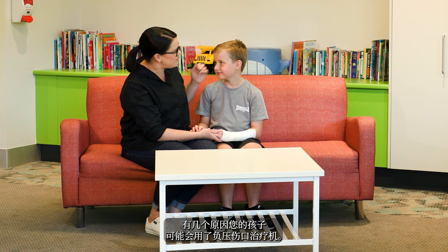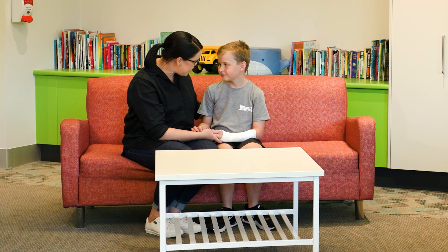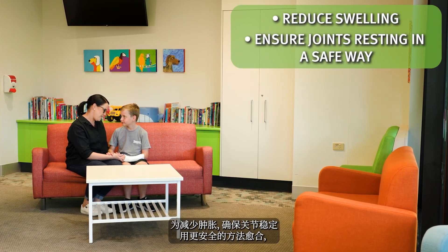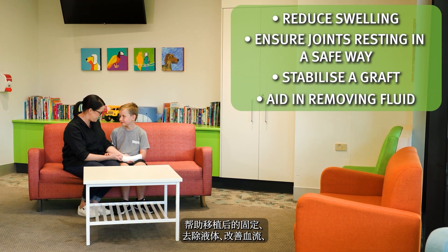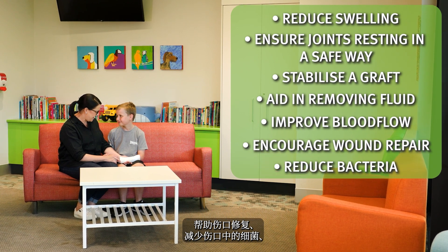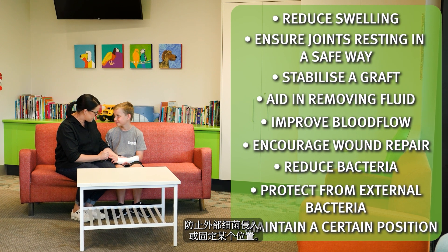There are several reasons why your child may have a negative pressure wound therapy machine applied: to reduce swelling, ensure joints are resting in a safe way for healing, help stabilise a graft, aid in removing fluid, improve blood flow, encourage wound repair, reduce bacteria in the wound, protect from external bacteria, or maintain a certain position.